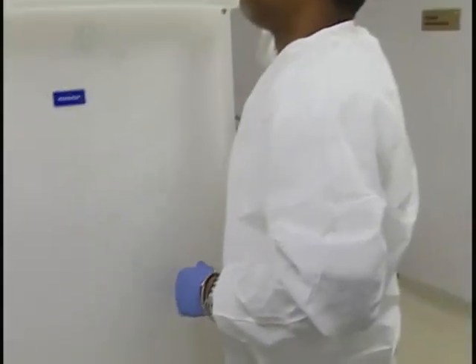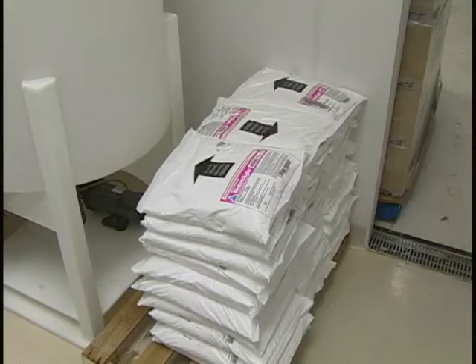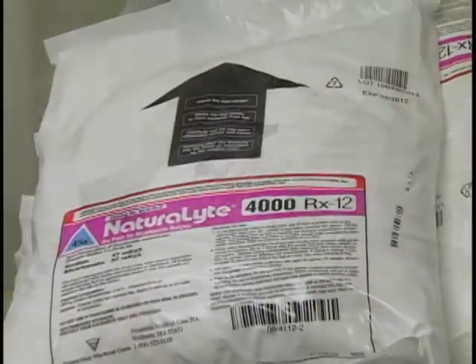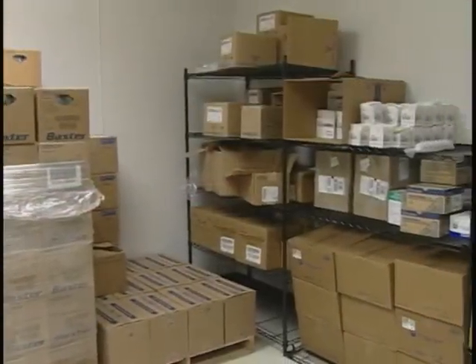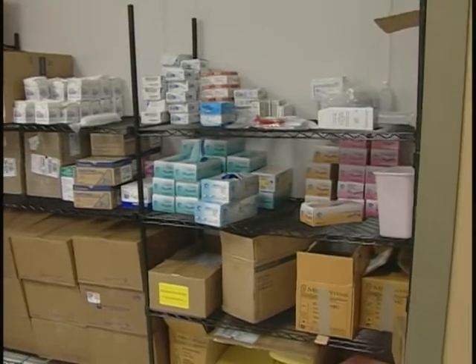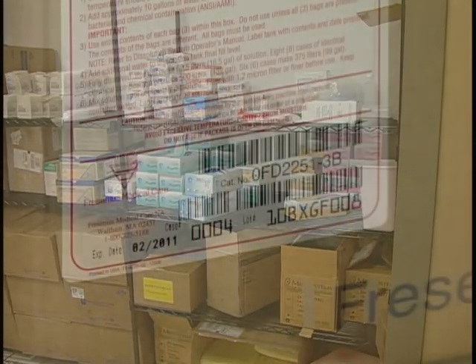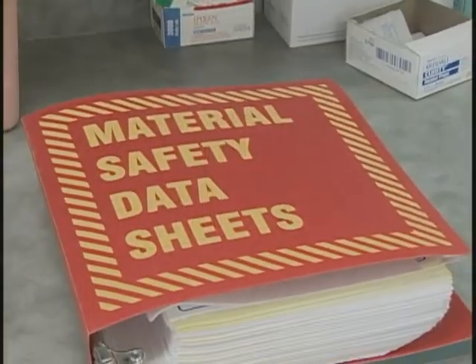Daily preparation of dialysate also requires that the dialysis treatment center store sufficient quantities of the chemical ingredients on site. As you survey the supply storage area, it is important to make certain that the stored chemicals are kept at the proper temperature, have not expired, and that the material safety data sheets, MSDS, are available.